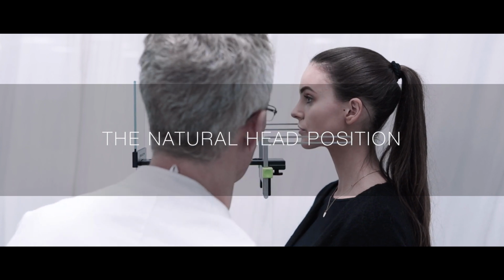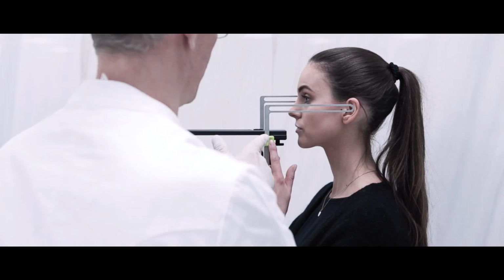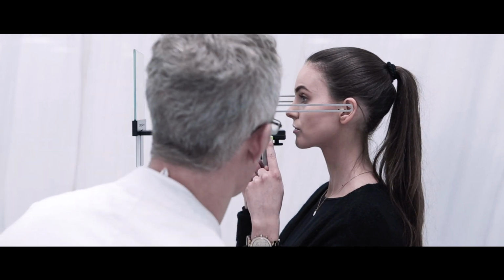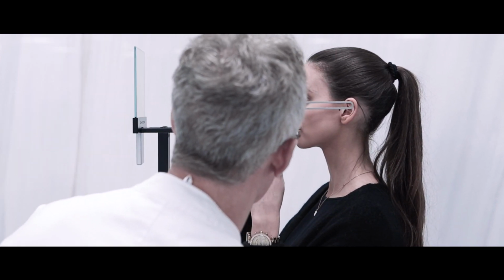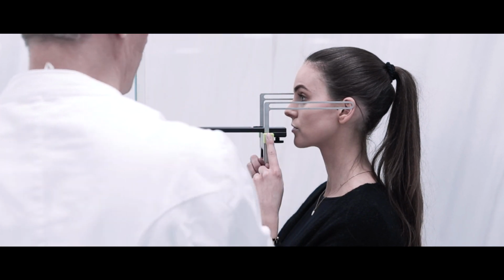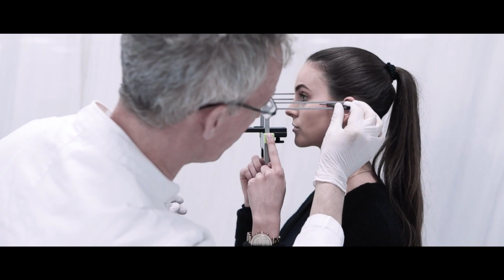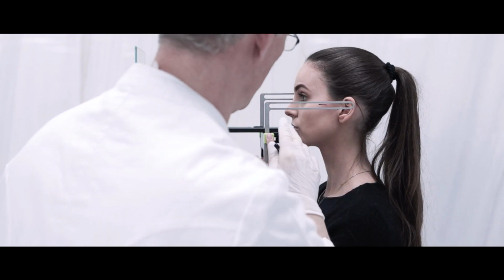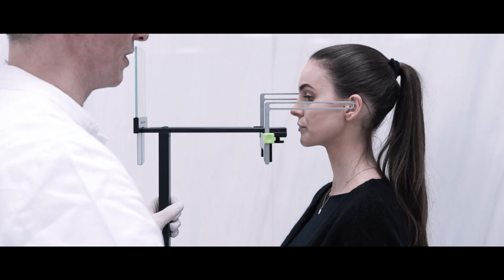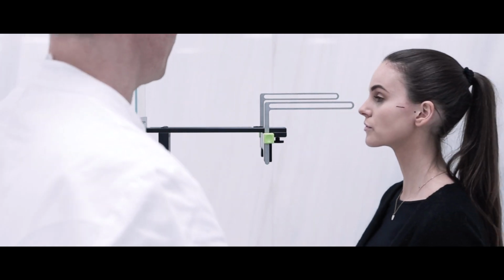After the first phase of facial scans, the dentist uses the PLANEFINDER to detect the natural head position and the natural plane. He asks the patient to stand in front of the PLANEFINDER for the final adjustments before acquiring the scans. Several recordings are made in order to verify that the natural head position is always kept. The dentist marks a guideline on the patient's face, at the level of the bar parallel to plane 0.